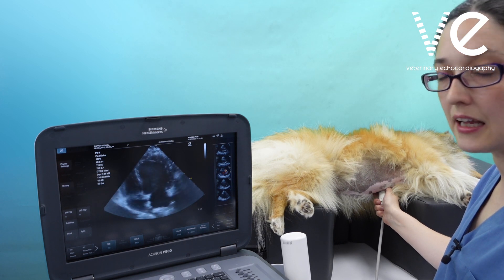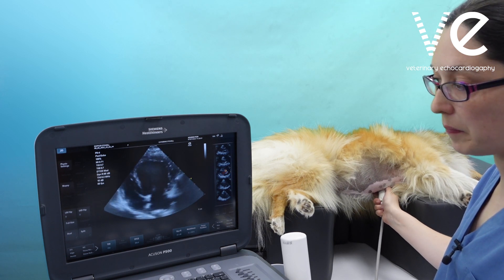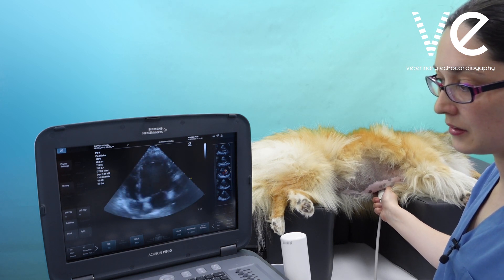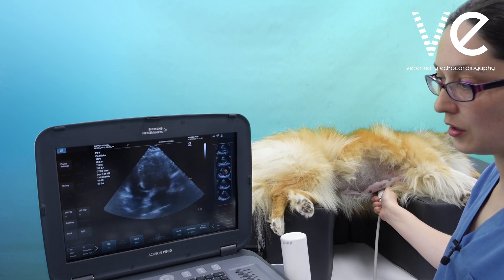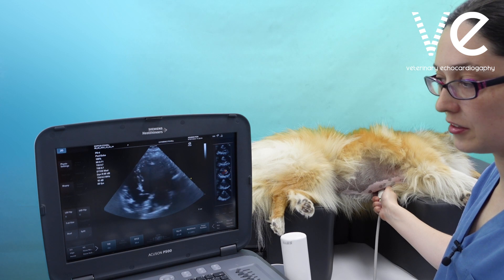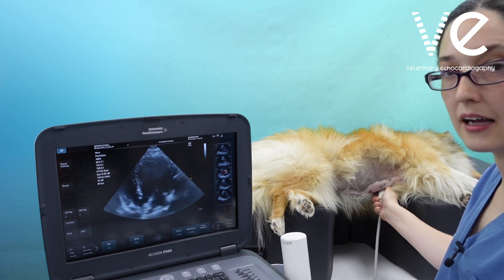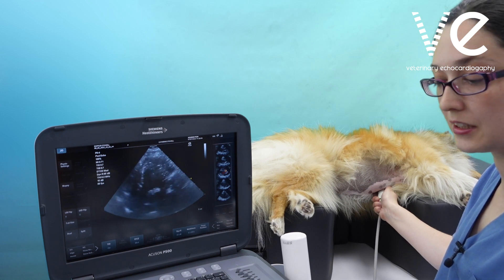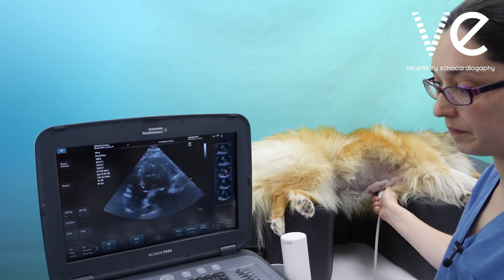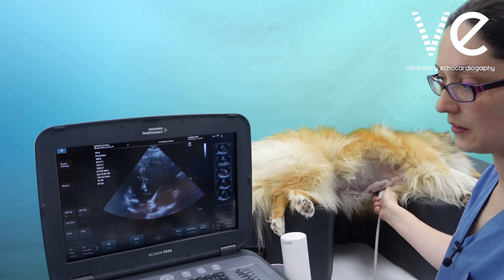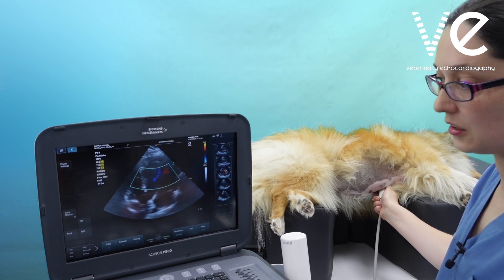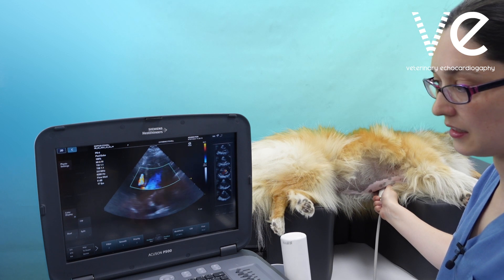Lifting the tail of the probe up, you can open up the left ventricular outflow tract and get your five-chamber view. You can put your colour Doppler over here.